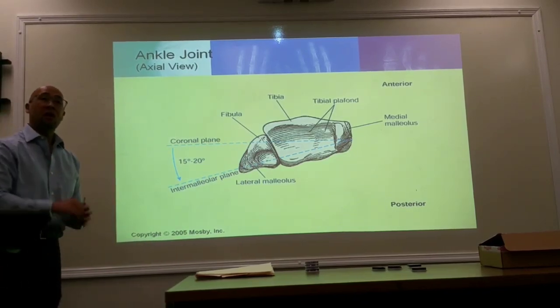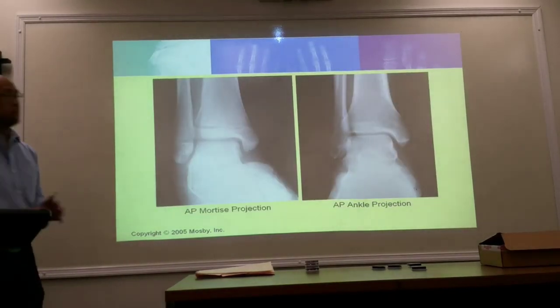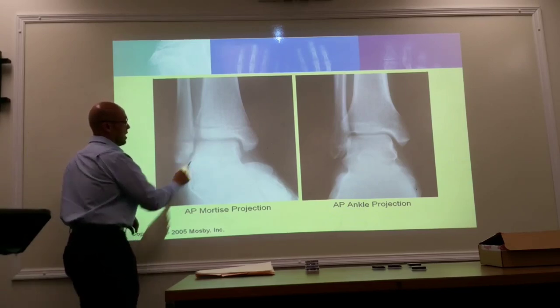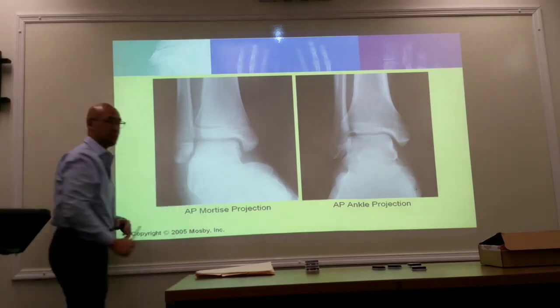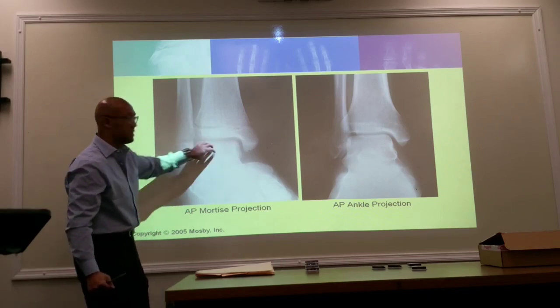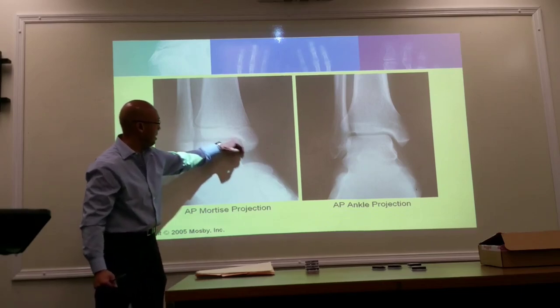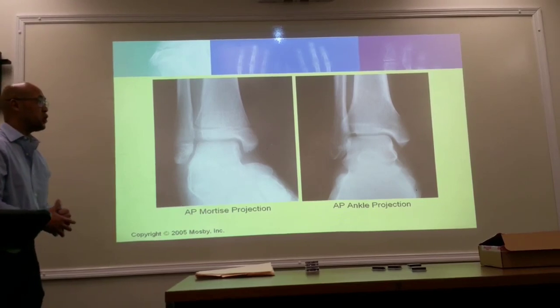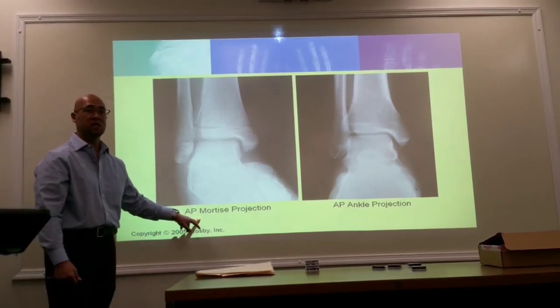So when we rotate our ankle 15 to 20 degrees, now we're going to open up that joint space between the tibia and fibula. You can also see the spacing between the two bones and the talus. Looks like a socket, right? Nice and open. It's open here and it's open here. When you rotate your feet medially between 15 to 20 degrees, this is known as the Mortise projection, AP Mortise projection.